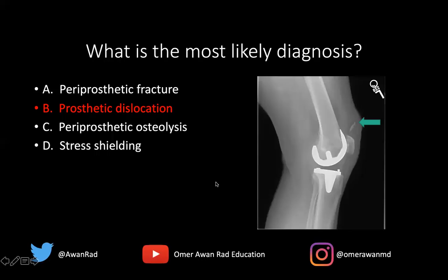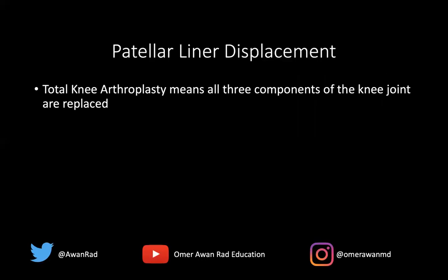This is a nice example of prosthetic dislocation where the patellar liner has been displaced superiorly. Remember, a total knee arthroplasty means all three components have been replaced: the medial femoral tibial, the lateral femoral tibial, and the patellofemoral compartment. A hemi or unipolar arthroplasty means only one compartment has been replaced. You always want to look at all three compartments carefully, because the femoral and tibial components may appear intact while the patellar compartment, as in this case, is not.